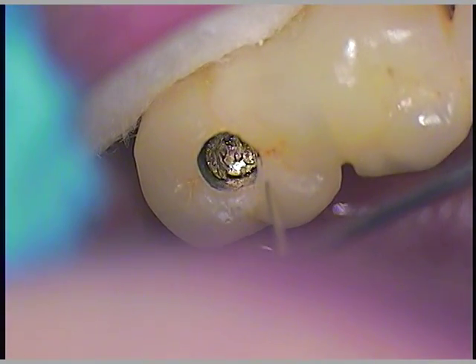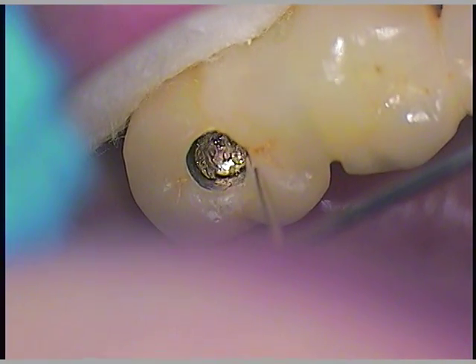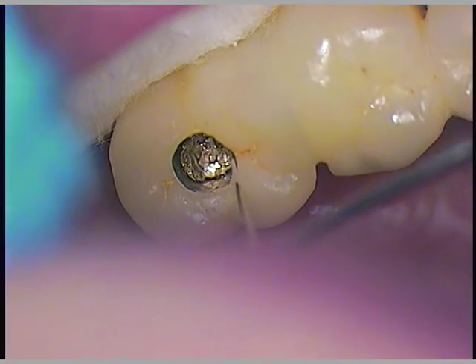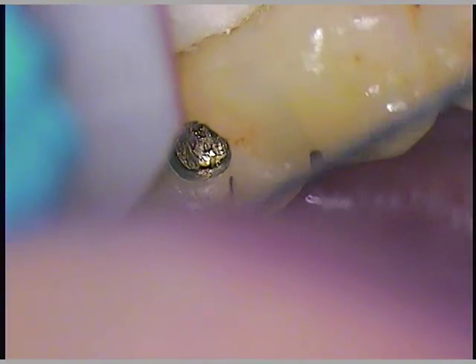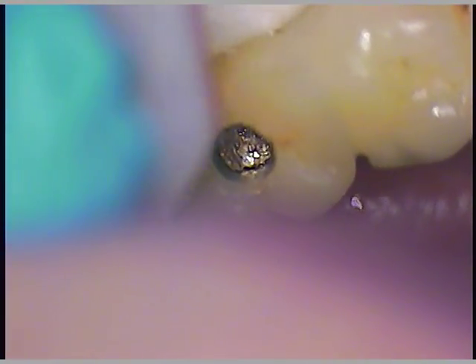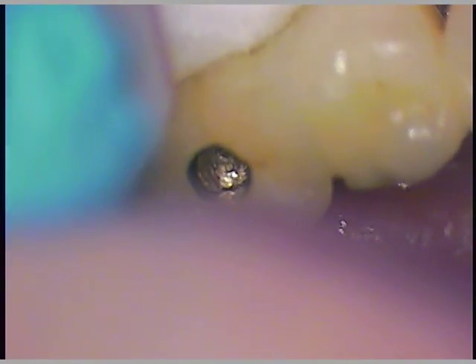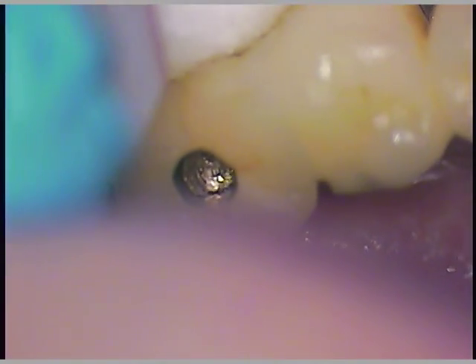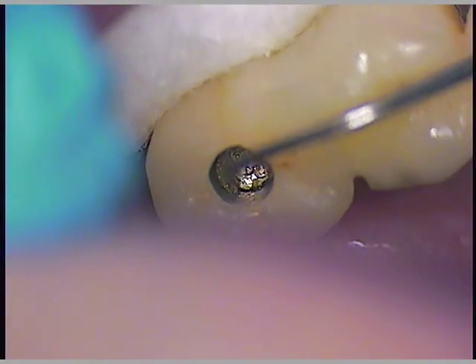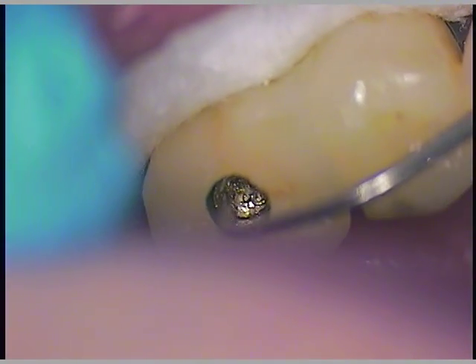We're actually developing some centering instruments right here. I'm going to give you a little composite — just a little bit. The centering technology, there's not enough of it out there. We have to develop some of it ourselves. That's why we're logging cases. We're really trying to develop a system to help our patients out so that they don't have to go through unnecessary surgery.